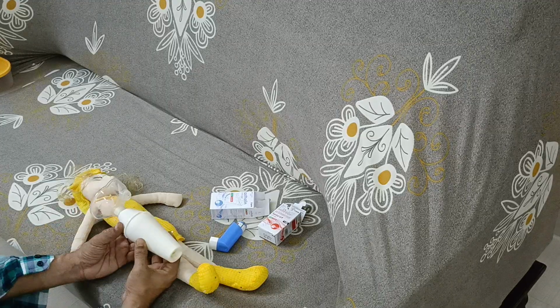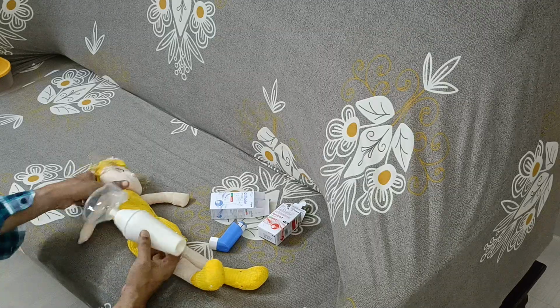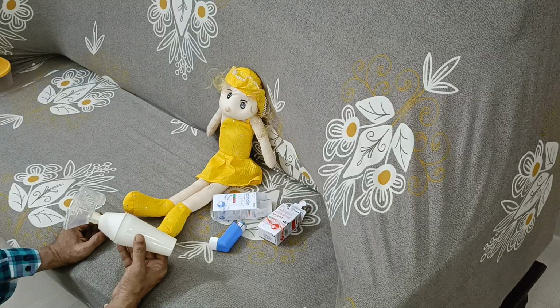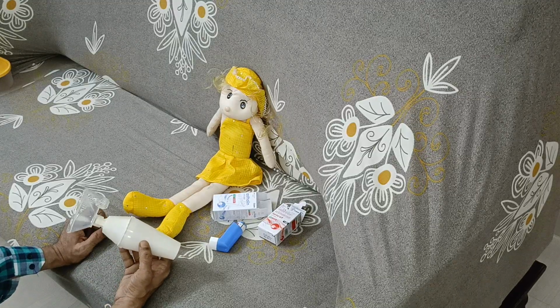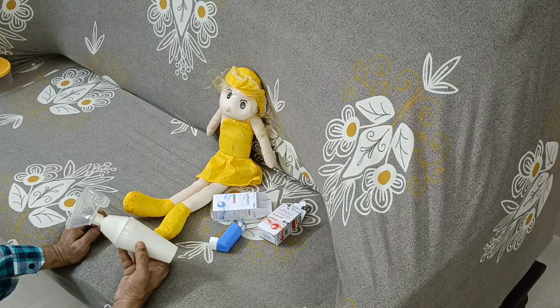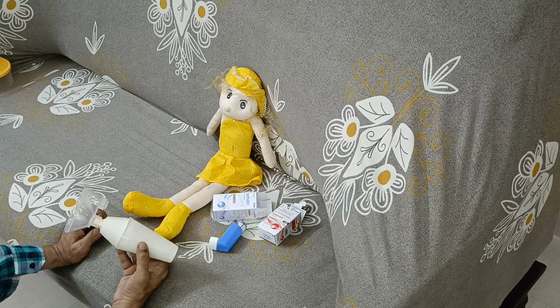Then, for example, this is a scenario in which I am going to leave the patient like this. You have to high up the patient. That's very important. Once the patient is high up, the other job is to ask the patient whether he had any bronchodilators just now or something. You can ask the patient that. There is no problem on that.